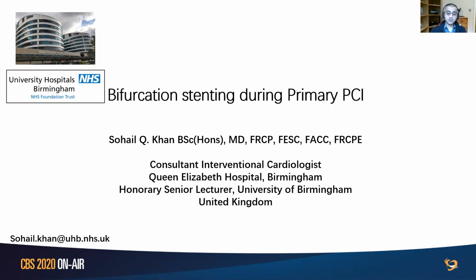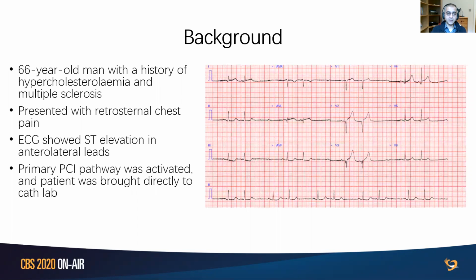I'm Dr. Khan. I work as a consultant interventional cardiologist in Birmingham in the United Kingdom. So I'm going to share today with you a case of bifurcation stenting during primary PCI.